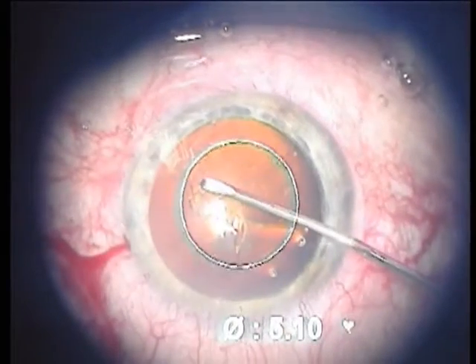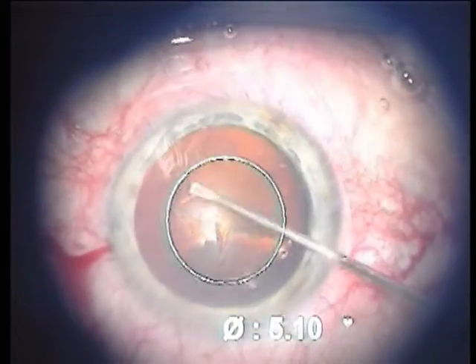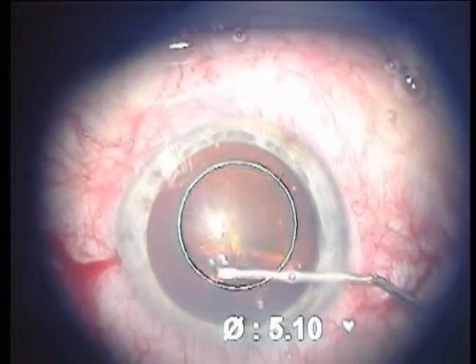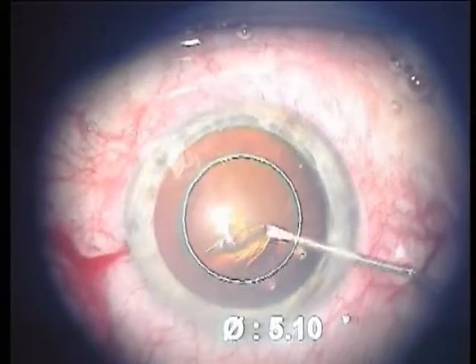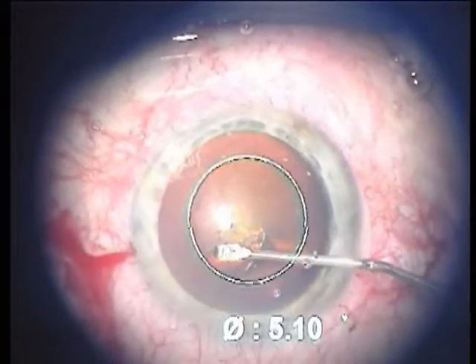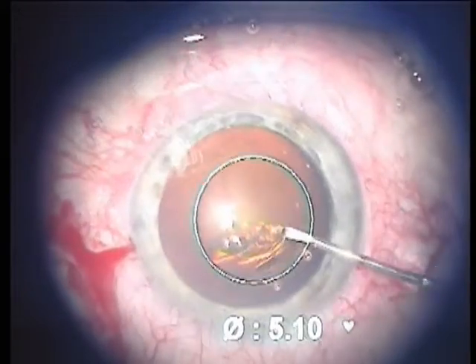Several additional applications, like the integration of a photograph or topography, are currently being investigated for anterior and posterior segment surgery.